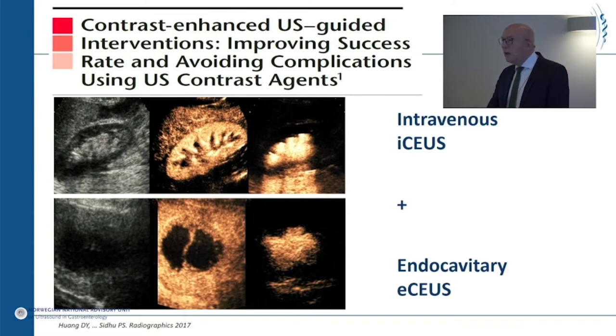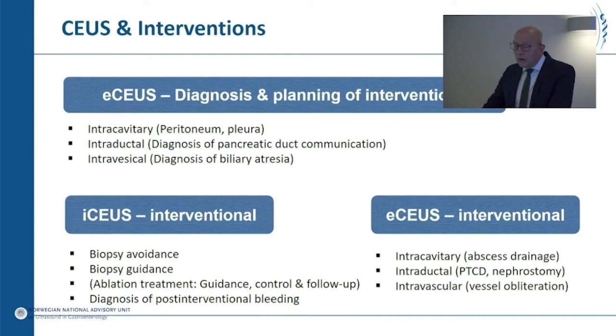And we can use it in two ways. We can use it intravenously, as usual, and we can use it endocavitary in several ways, and I will show you some examples. This is my agenda.